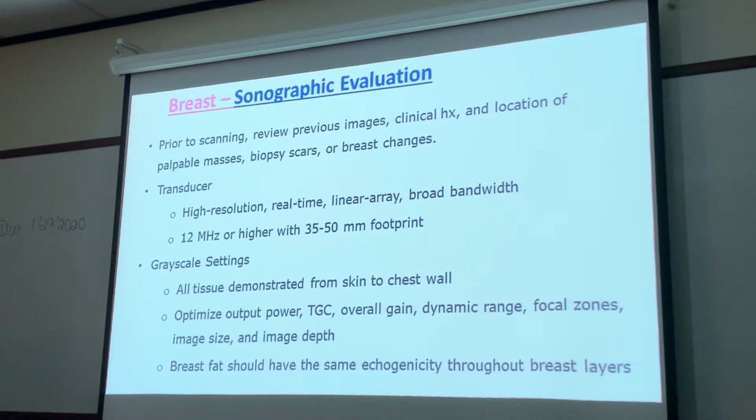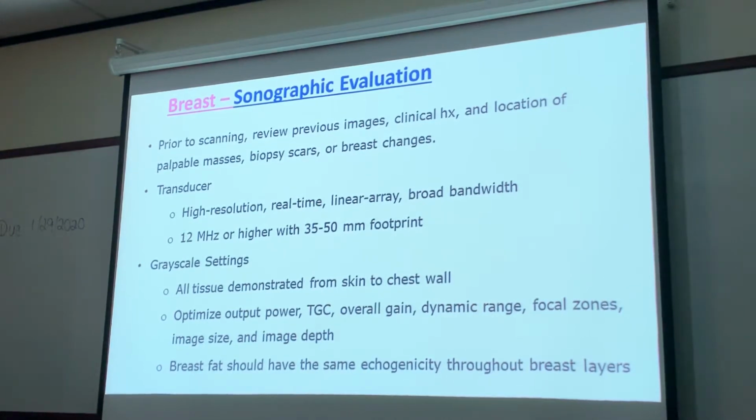Which one are you going to be using on the test? When we're talking about superficial structures, we always want to go with the highest frequency. I may or may not bring that question back. It said it specifically in the book, did it not? The highest frequency available. So that way you can't combat me, because I read just like you read, right? Goodness, that is the question.